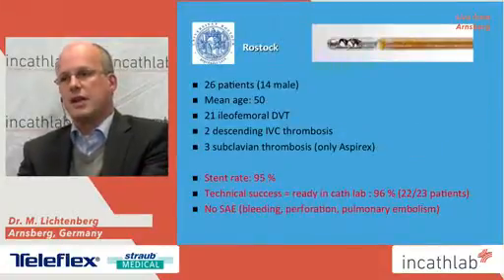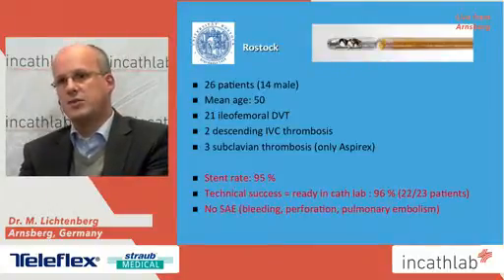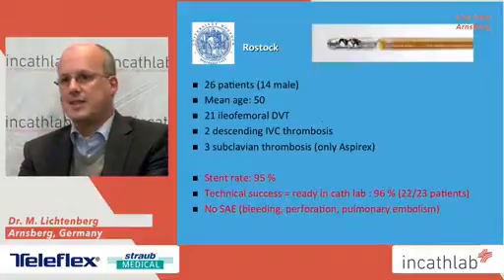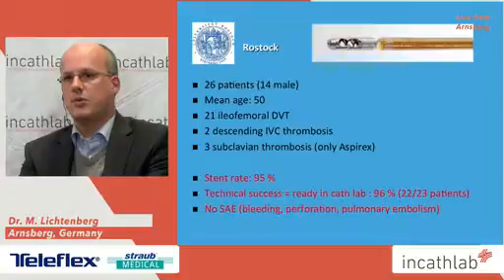And here is the experience of the Rostock group. They treated 26 patients. The mean age was 50 years. 21 of these patients had an iliofemoral DVT, 2 of them a descending IVC thrombosis, and they also treated 3 subclavian thromboses, only with Aspirex.